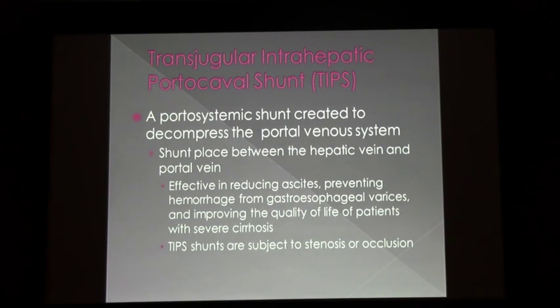Can I ask a question? I'm sorry. Yeah. So when you have a recanalized periumbilical vein, what is the left portal doing? Because I hardly ever see it. The left portal's still coming. No, the recanalized periumbilical vein. So whenever I try and find it, I can never find it. It should be extending off of it. And remember, not everybody's veins look the same.